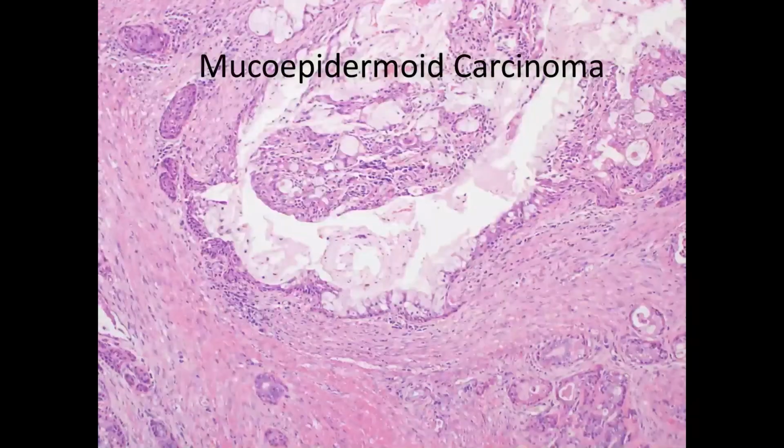In a resection, this ended up being, again, a low-grade mucoepidermoid carcinoma. One question the surgeons may pose in an aspirate when you diagnose or suggest a mucoepidermoid carcinoma is whether you think it's a high-grade or a low-grade tumor.